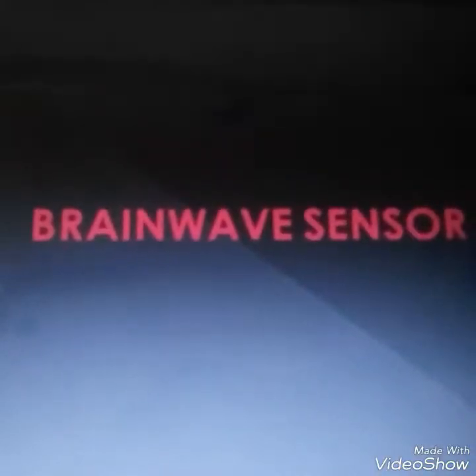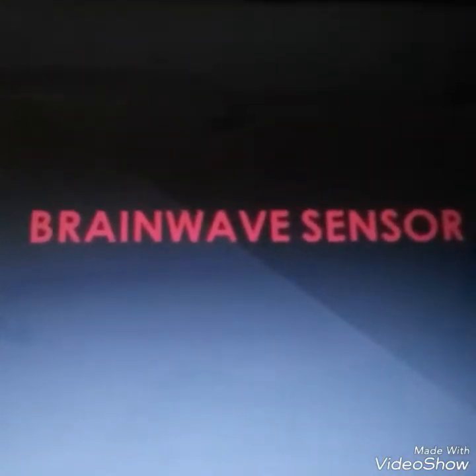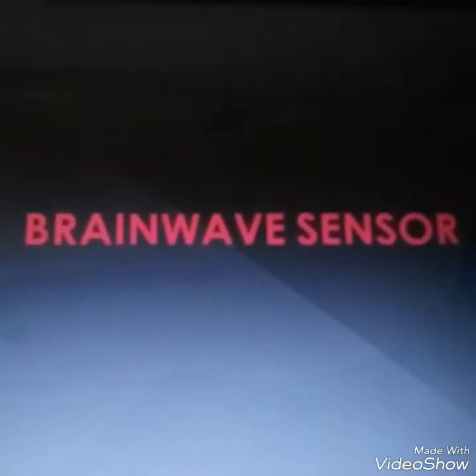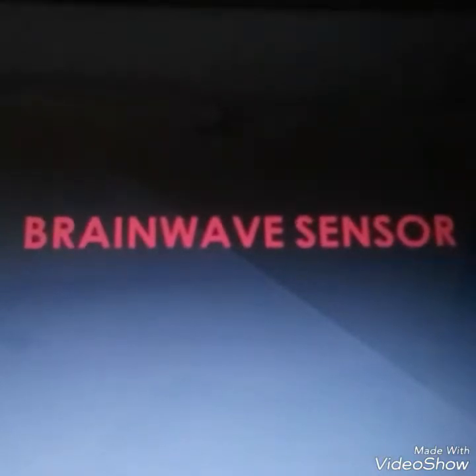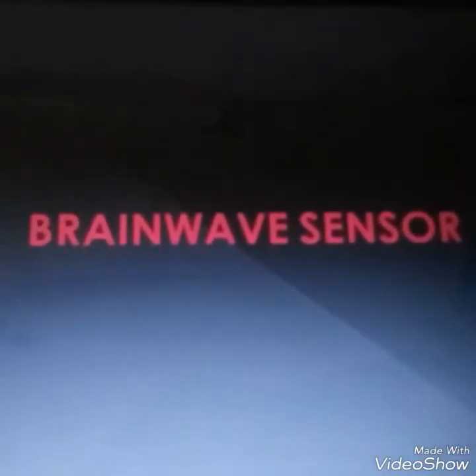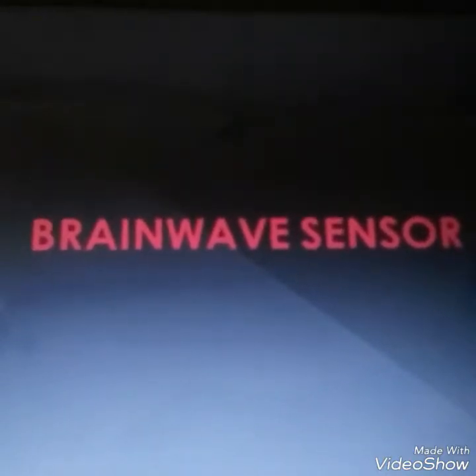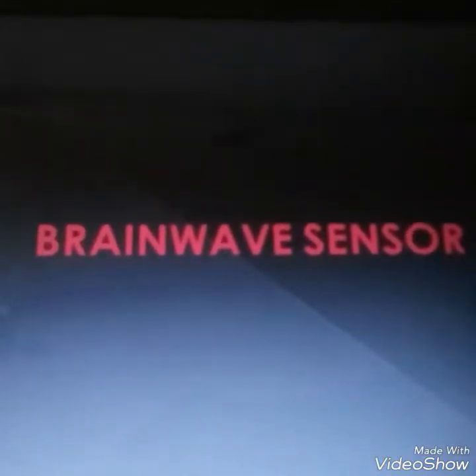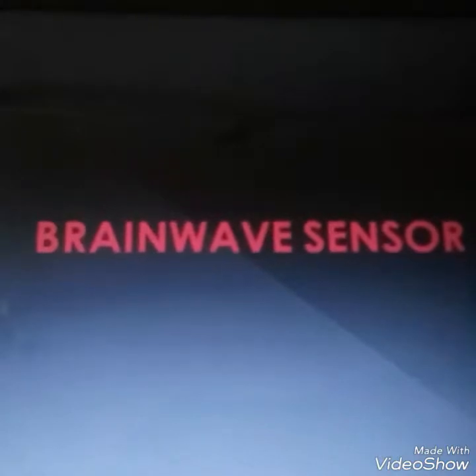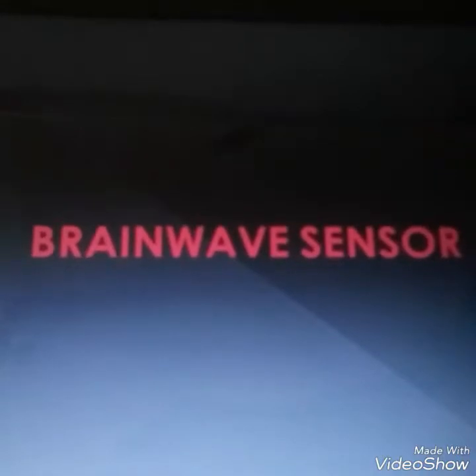Now about the brainwave sensor. The brain is made up of nerve cells called neurons. At the end of every neuron, neural impulses are transferred to the next neuron in sequence, like a cardiac impulse. Each time this happens, a tiny spark jumps, and anytime a spark jumps, it produces a radio signal. These signals passed by the electrical impulses of neurons must be amplified greatly by electronic circuits to become a measurable signal. The EEG recorder collects the signals from the electrode which is in contact with the skin. The skin is our scalp, where the brainwave sensor is worn.